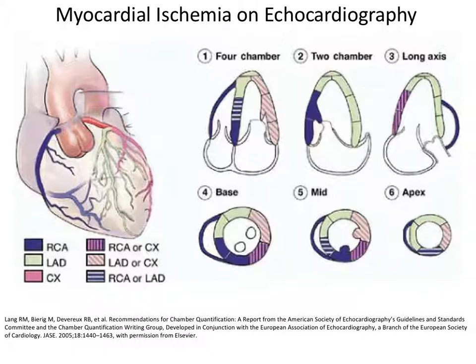I'd see the thrombus go off my catheter. Oops, I dropped it, right? Whoosh, down it goes into the left ventricle. And then you try and chase it. You're not going to catch it, right? So that's the worst thing that could happen. So how do you prevent that damage? Let's put in another device. What should we put in such that that won't happen?